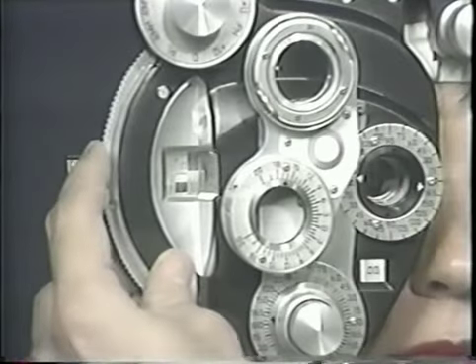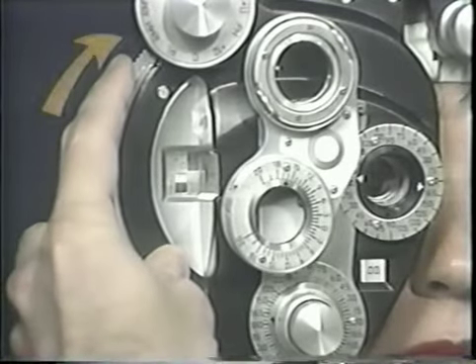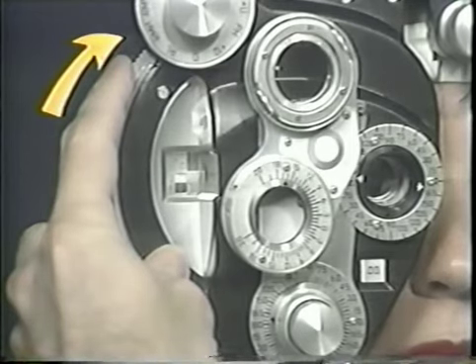T-Z-V-E-O-L. Fine. Now, is this still better or just smaller and darker? Ready? There. Just smaller and darker. Good. When the sphere is changed in the minus direction, the letters may first become smaller, darker, and clearer.